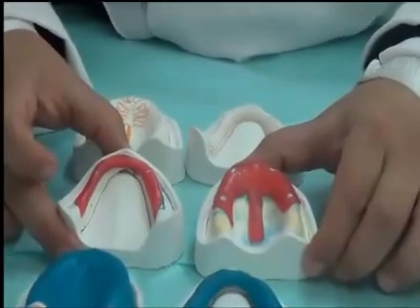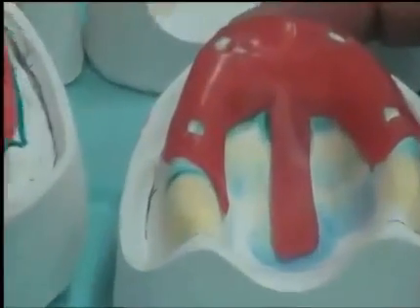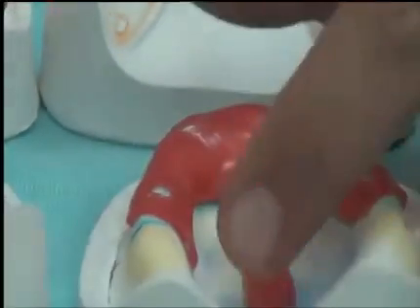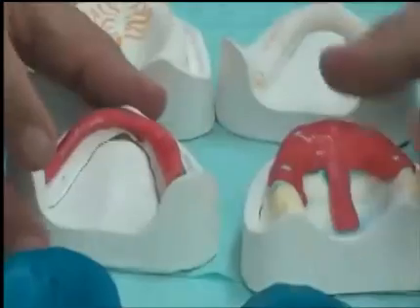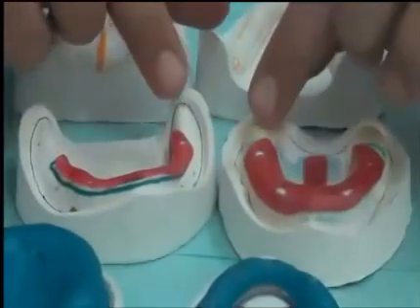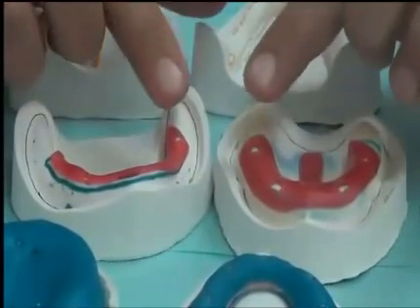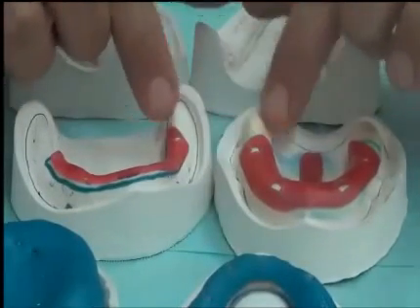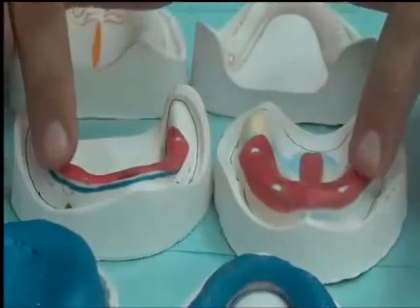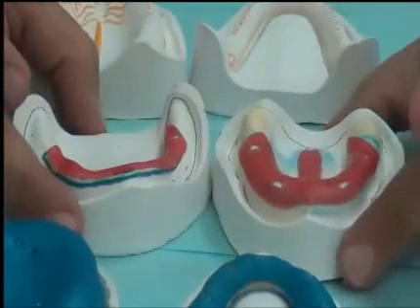And once I want to begin my impression, I remove the wax, and the impression material here will have a lot of sufficient space. While in the areas of support, the support areas, the impression material will be closely and firmly pressed by the tray and the soft tissue, so these are compressed. While the areas where the wax was, it will be mucostatic, not mucocompressive.